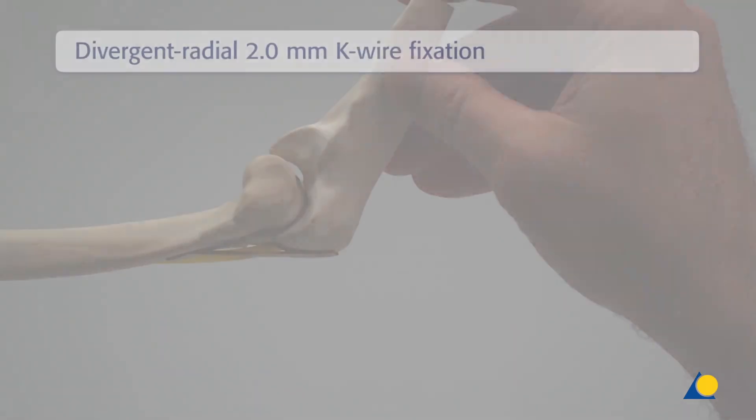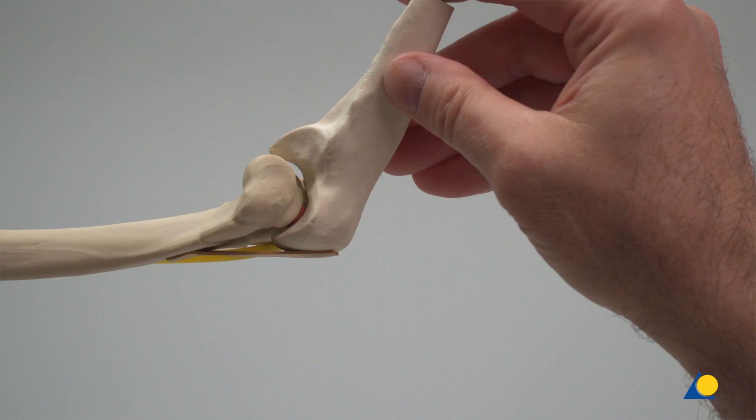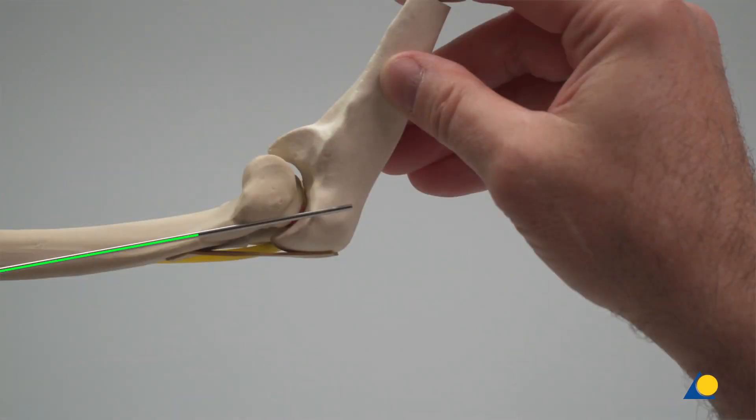The divergent radial technique using 2.0 mm K-wires from the radial direction will now be demonstrated. In the clinical situation, a small incision or a direct puncture with the K-wire is made over the planned entry point. 2.0 mm K-wires provide increased stability and this technique allows them a high level of insertion precision.